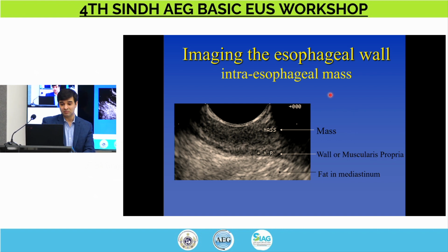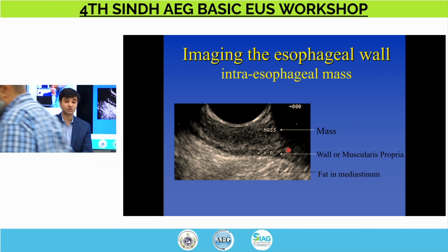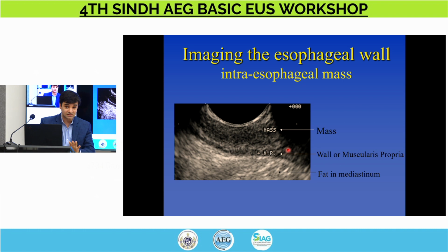Now, imaging of the esophageal wall is crucial in patients with cancers of the esophagus. One of the more common indications that we get for diagnostic EUS is preoperative staging. It determines how patients will do. Back in the day, we used to think it important to dilate up malignant strictures and have your scope pass through, and now there is data that suggests that if you cannot pass a scope down, you're T3 or above, so you want to not dilate esophageal stricture.